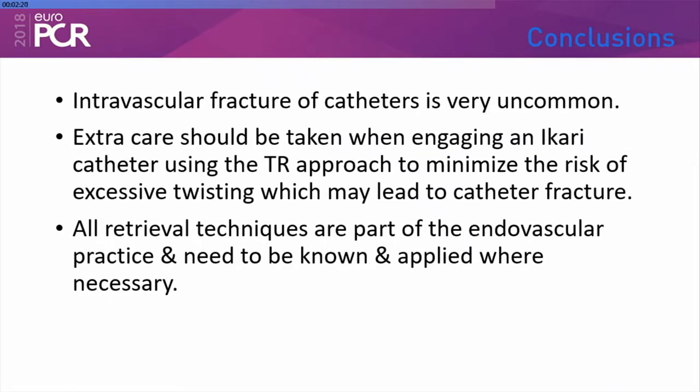So my conclusion is intravascular fracture of catheter is very uncommon. Extra care should be taken while engaging an Ikari catheter using the TR approach to minimize the risk of excessive twisting, which may lead to catheter fracture. All retrieval techniques are part of the endovascular procedure practice and need to be known and applied where necessary.